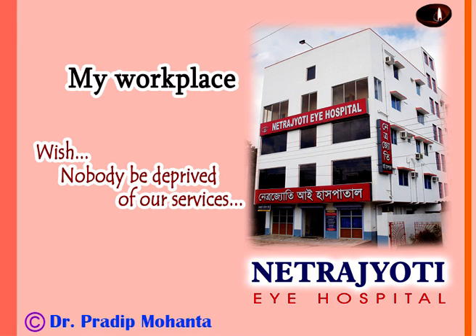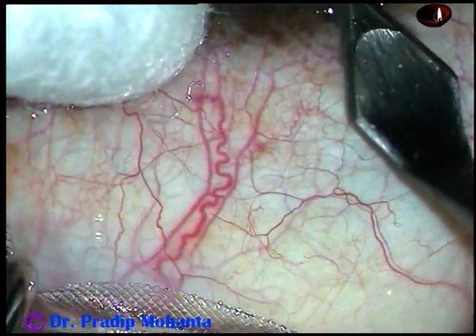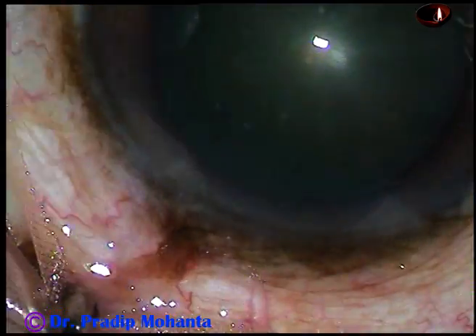Friends, welcome to my workplace at Ranaghat, West Bengal, India. In this video, we are going to see how to manage the nucleus when the capsulorhexis is small. Let us observe the surgical steps.